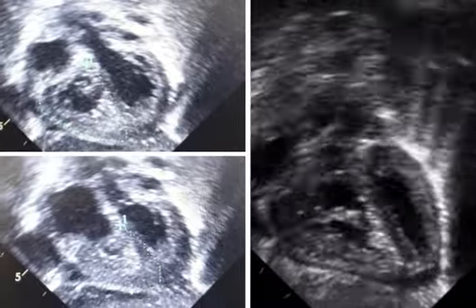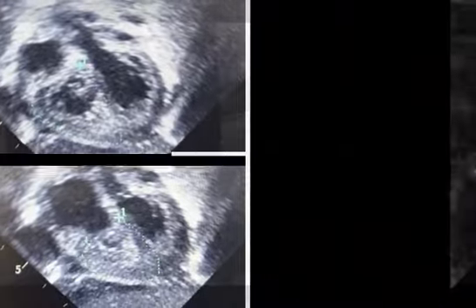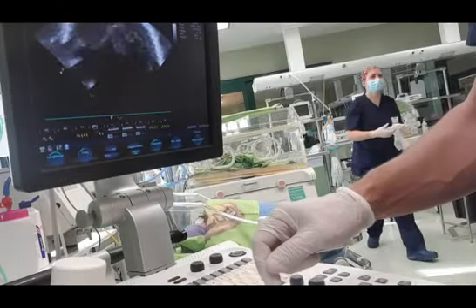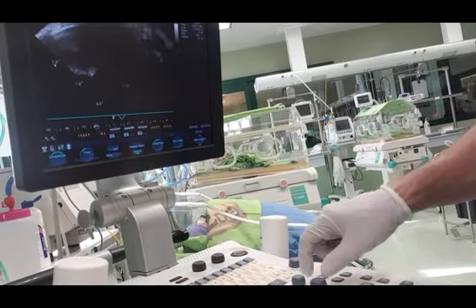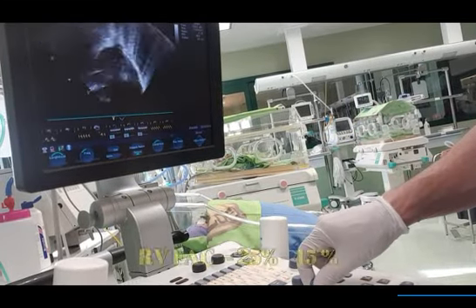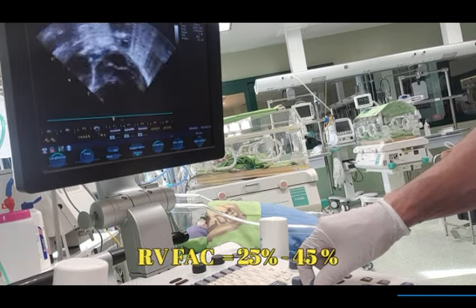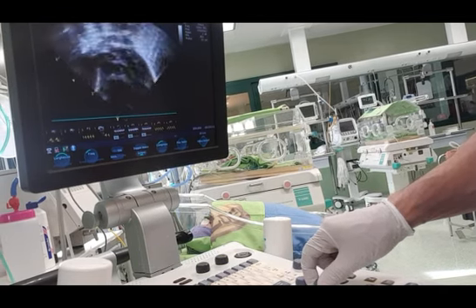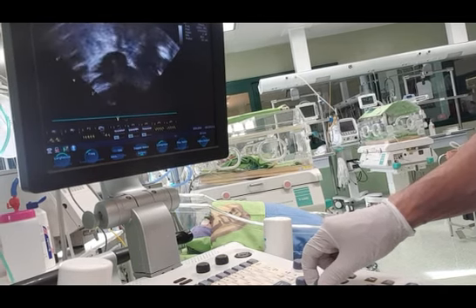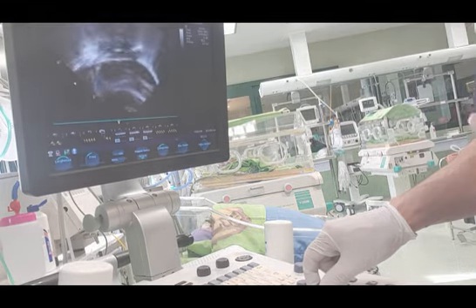Trabeculation should be included within the cavity under the tracing procedure. Normal values in preterm and term infants have been published, ranging from 25% to 45%. Median values below 20% are highly associated with the need for ECMO or death.